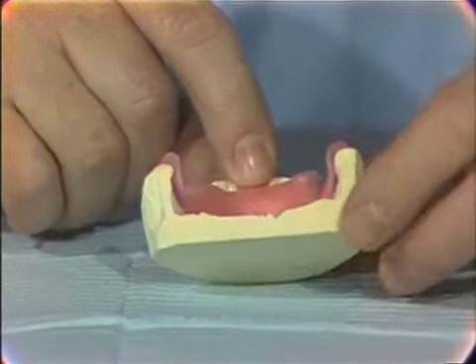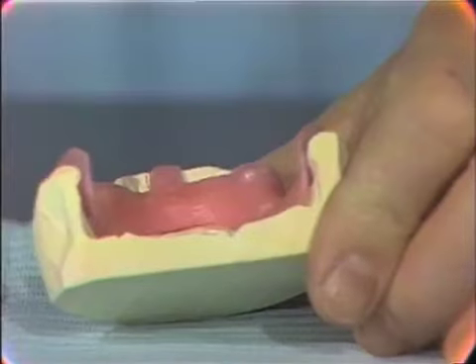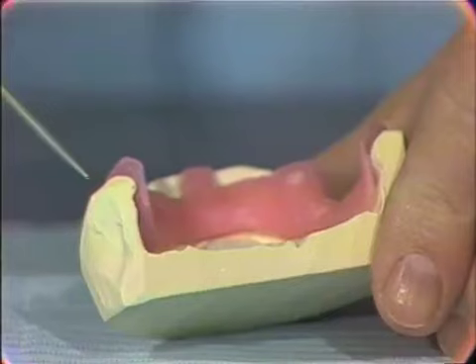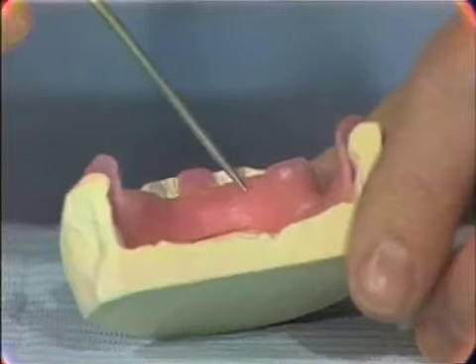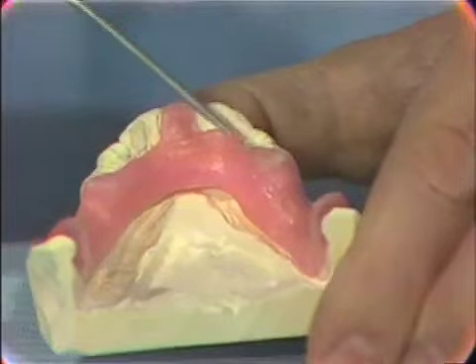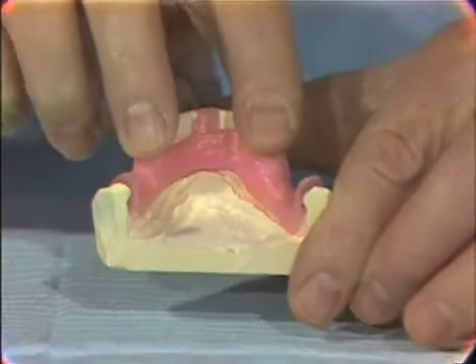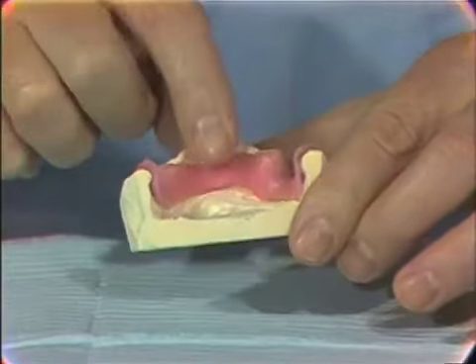Things you look for here is you would see that there's relief between the tray and the ridge area. Sufficient relief for the escapement of the impression material from the tray. There's sufficient bulk in the lingual area here so that we get the rigidity we need. Now you can go ahead and use the teeth as stops. As you see here, we've extended the tray up over the occlusal surface, the incisal edges of the teeth, to provide stops for the placement of the tray. In order to position the tray and keep it from touching the ridge tissues, these stops can be useful.